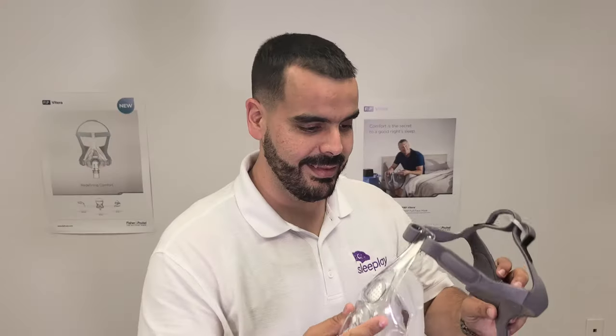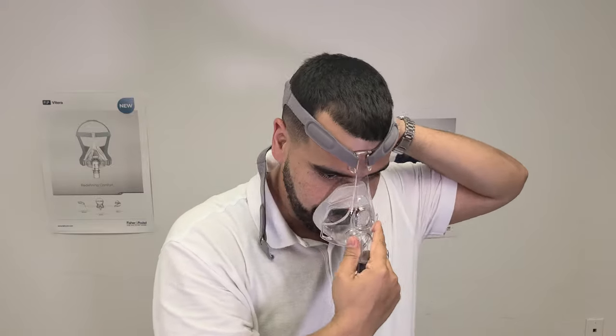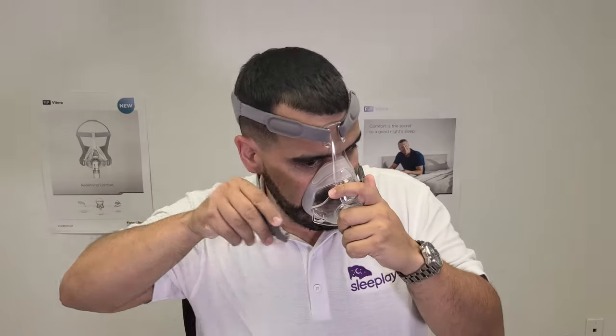Tip number one: put your mask and machine on during the day before you go to sleep. This doesn't treat your sleep apnea, but it helps you get used to the mask and CPAP pressure. You can watch TV, read a book, or listen to music. It helps you adjust to the pressure points and the sensation the machine gives you.